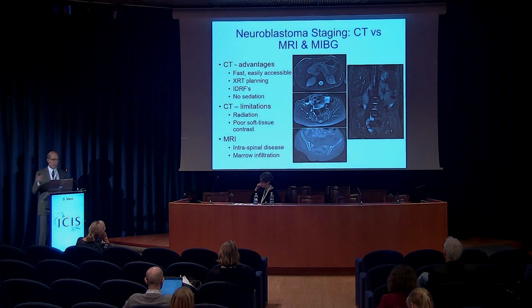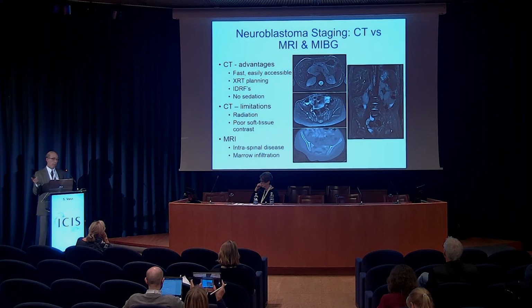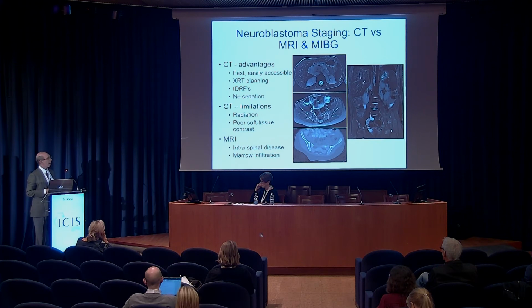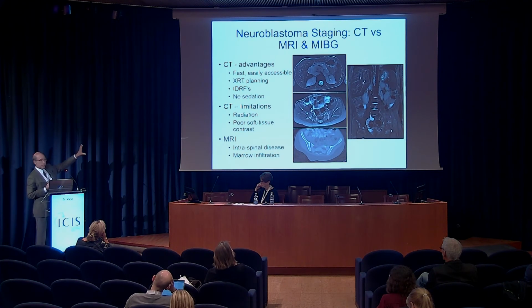Now the question comes up, CT or MR? If Kieran McHugh's here, I know Kieran will say MR. Don't throw away your CT scanners. He's anti-CT. CT still has a lot to offer. There are advantages. It's fast. It's easily accessible. Important for radiation treatment planning. It allows us to calculate those IDRFs, oftentimes very successfully, with faster scanning techniques, many times no sedation.